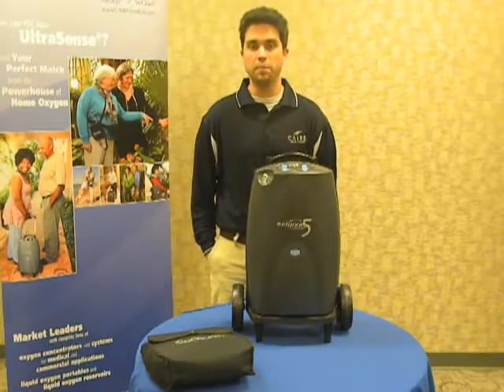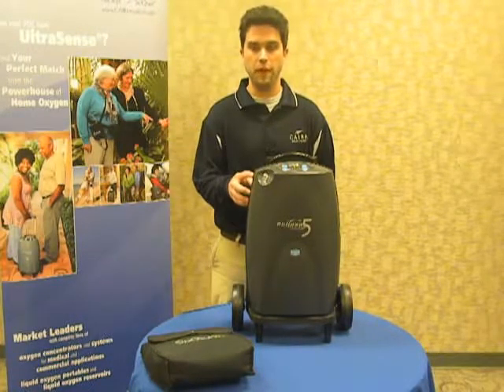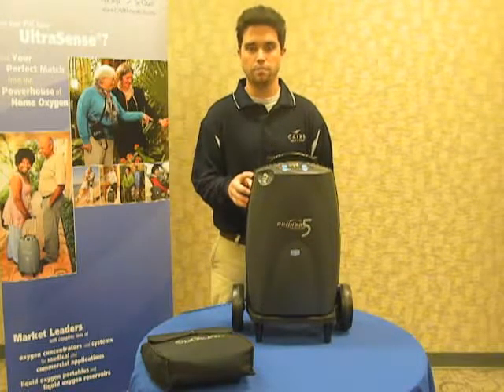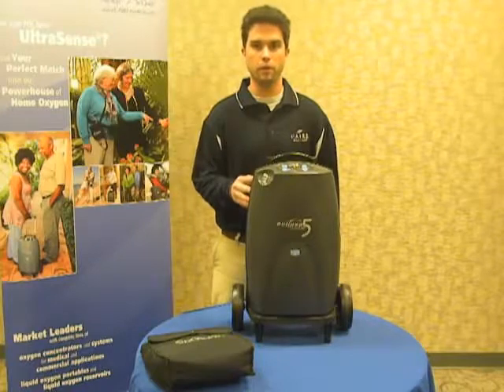Again, remember on DC power, the Eclipse will run at all settings up to 3 liters per minute continuous and pulse settings up to 9, and it will also recharge your battery cartridge at flow settings 2 liters per minute or less. Now we've explored all three power sources and we're ready for you to get going with your Eclipse.